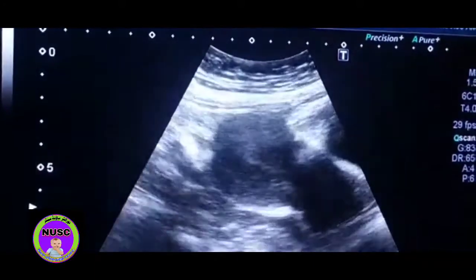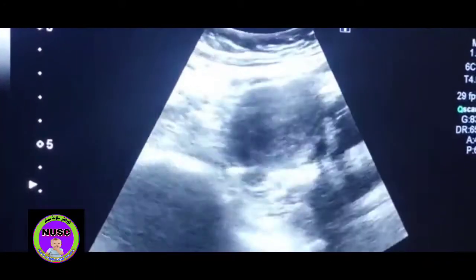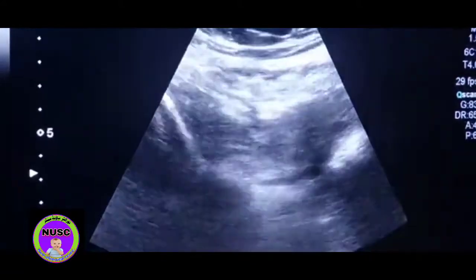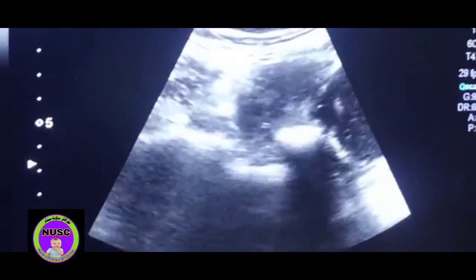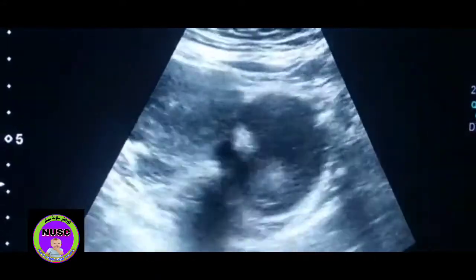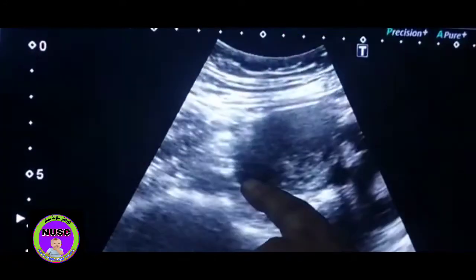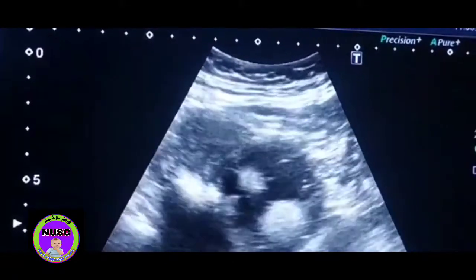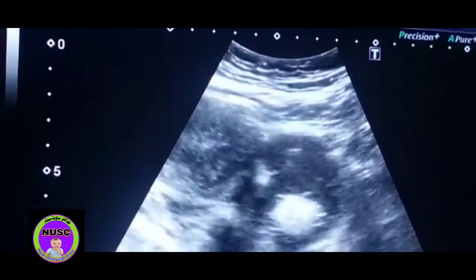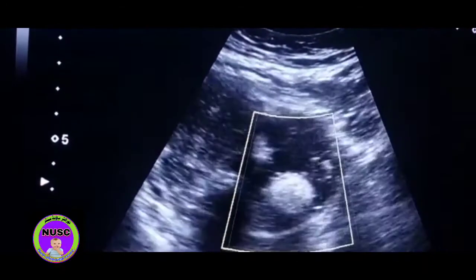We are performing a pelvic scan here. This is the uterus, and this is the left ovary — very small, this one. This is the right ovary, and this is the mass in the left adnexa. Very typical, very typical dermoid cyst.